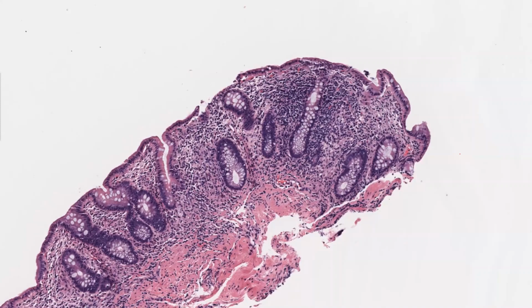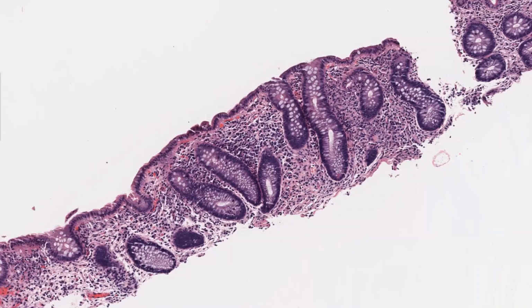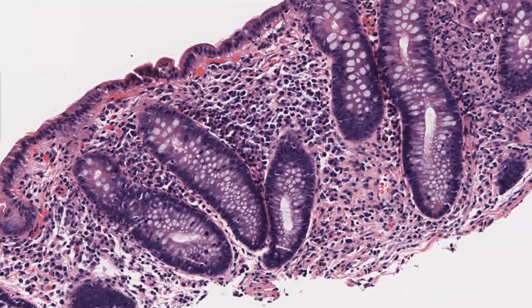So this is from a pouch, right? And this is the biopsy. You look at it: inflamed, maybe, looks more lymphocytic in places, but the surface looks okay. Then another biopsy from a different area, where the gradient is lost, so it looks inflamed. And then another biopsy close-up to show you that the intensity of inflammation looks a little higher than you wanted it to be.